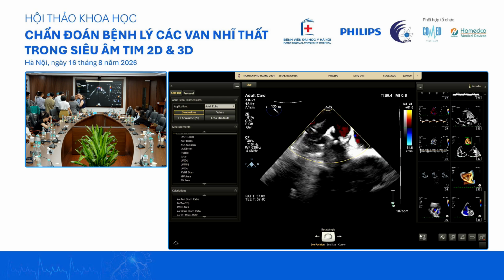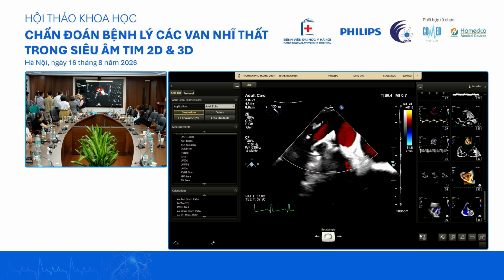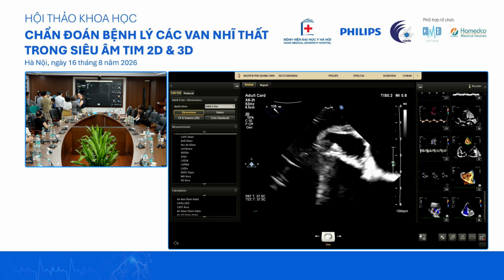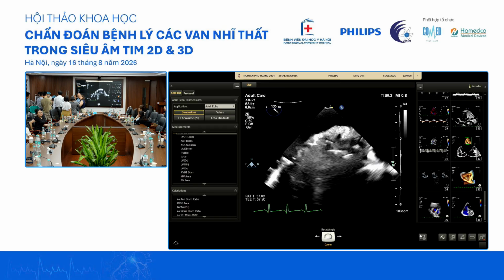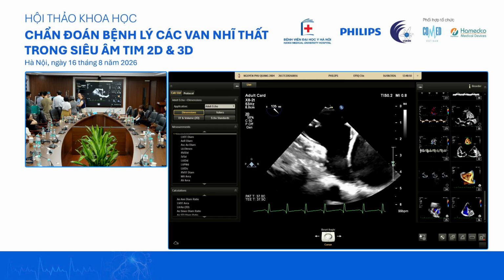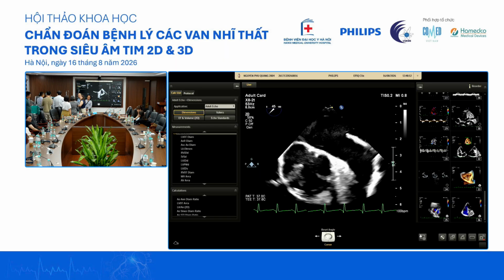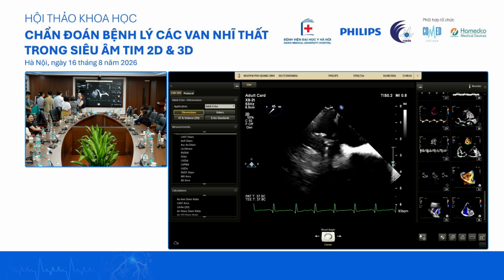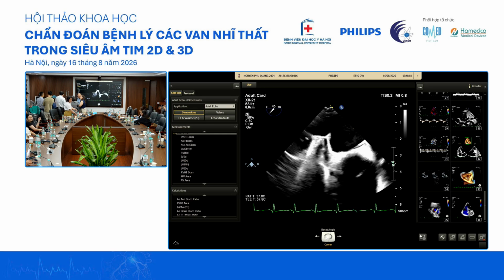We don't want to change the position of the patient, so we have 2 sides at the same time. The previous doctor is on the left side, and because it's for transthoracic, we use the same side. The room is small, so we don't need to move the machine. So we try again. We usually do on the left ventricle.